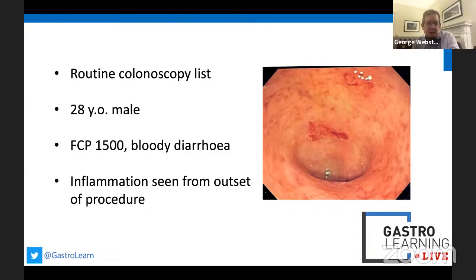During this endoscopy, do we carry valiantly on to do a full colonoscopy? And what are the situations in which you wouldn't proceed much beyond what we're seeing here? Okay, well, first of all, thanks, George, to you and Dave for inviting me to have this conversation with you today.